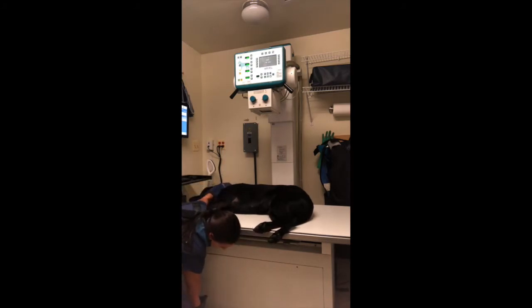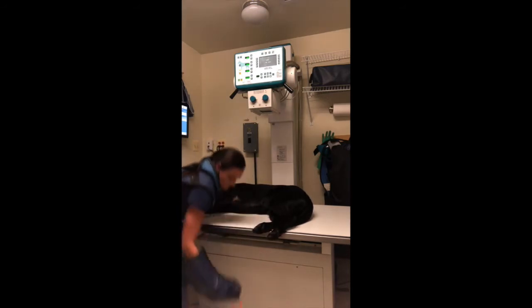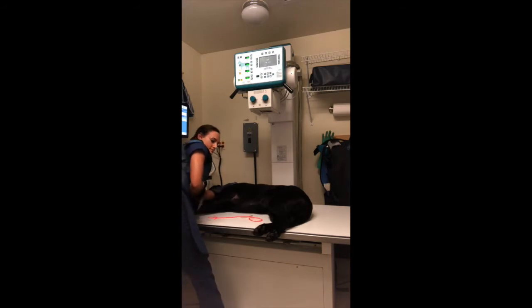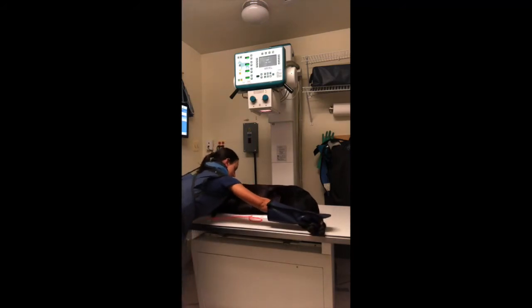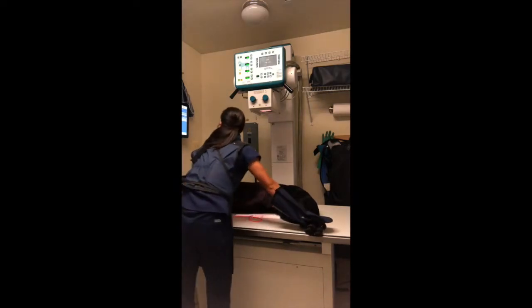The formula for orocolic transit time: first, you want to count the number of BIPS that are in the colon and calculate it as follows: the number of BIPS in the colon divided by the total number of BIPS seen on the radiograph times 100 gives you the percentage of BIPS in the colon. Remember to calculate the small and large spheres separately. The total number seen on the image will be a maximum of 10 large and 30 small spheres. Apply this percentage to the appropriate chart.